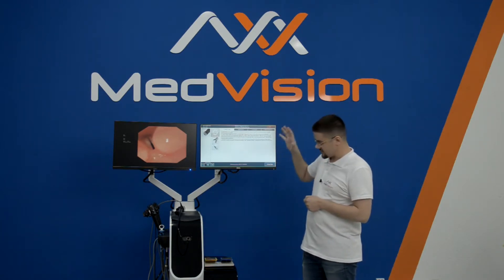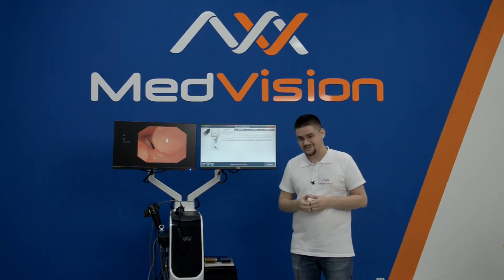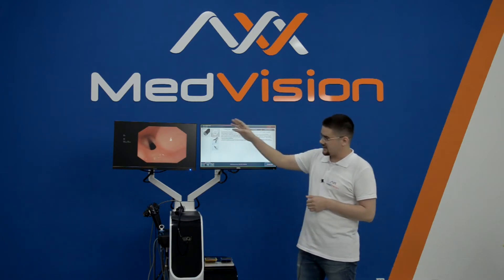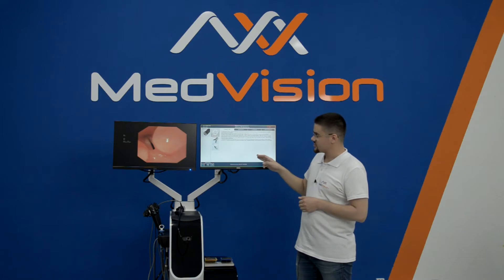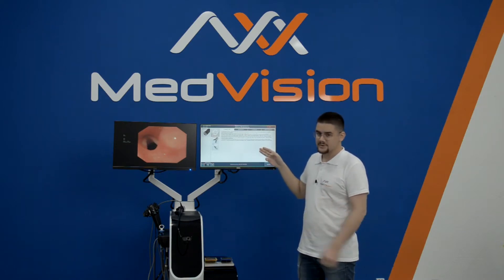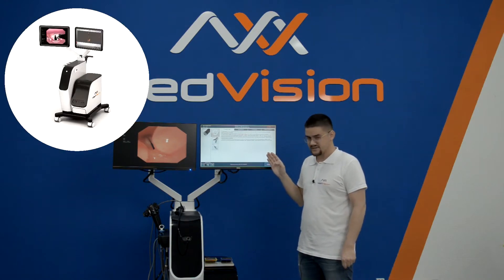Here we have a unibody design on a mobile platform, which makes it very convenient for simulation centers. There are two monitors up top with anti-glare coating, full HD, and both a non-touchscreen and touchscreen with menu controls optimized for this — very similar to other MedVision designs.